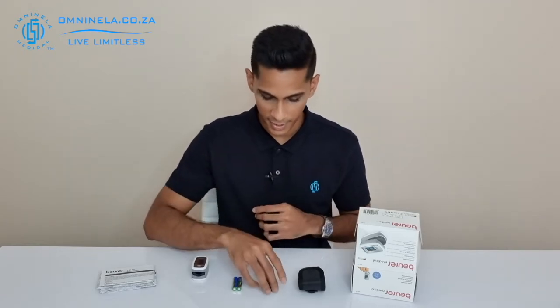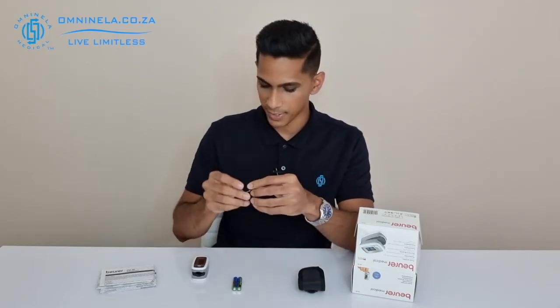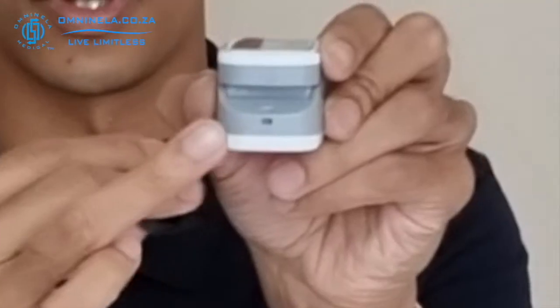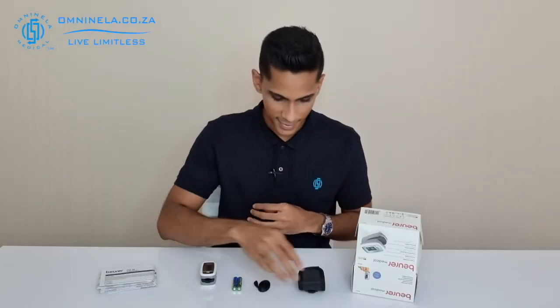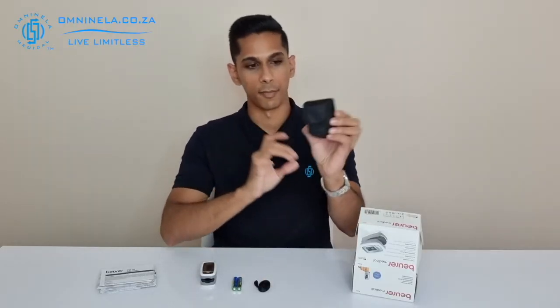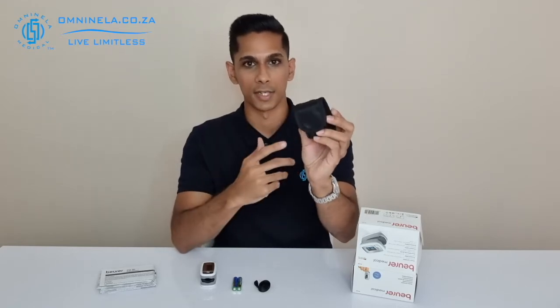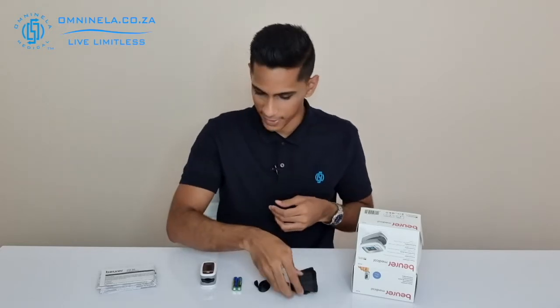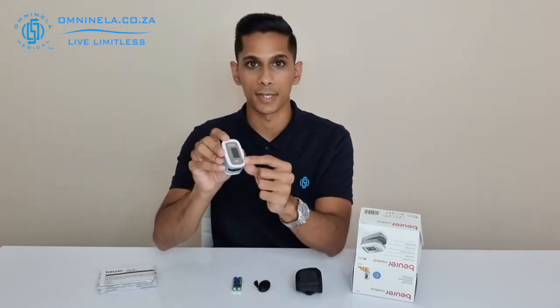You've also got your strap which is included, so if you do need to attach it to your wrist for safe keeping, you can always attach it from the strap to the little loop that you'll find on the back end of the device. You've also got the pouch, which is a soft black material that will have the belt loop just on the back side of it.